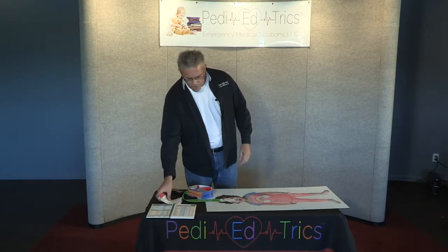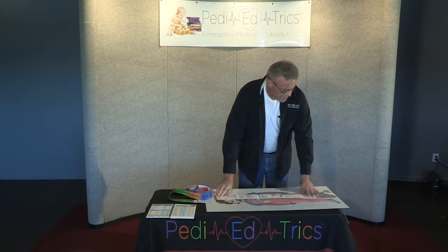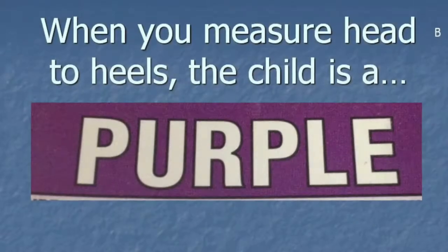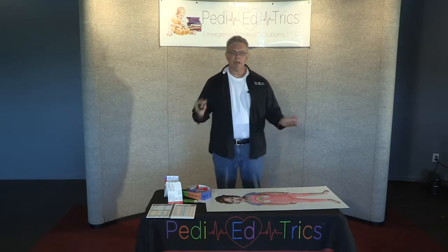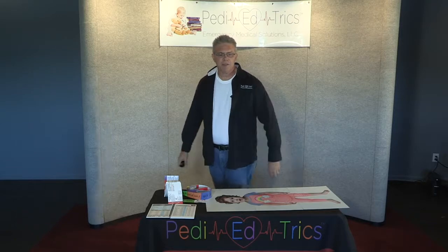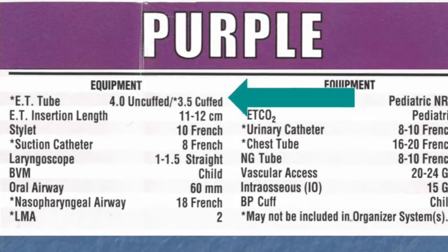Now, when it comes to Broselow, remember, if you're purple on one, happily, if we go red to the head and measure down to the heels, we're purple on the other as well. So when you take a look at the Broselow tape, remember, you have E&E, epi on one side, and endotube on the other. And on the Broselow tape, it tells you that a purple child should get a 4.0 uncuffed.